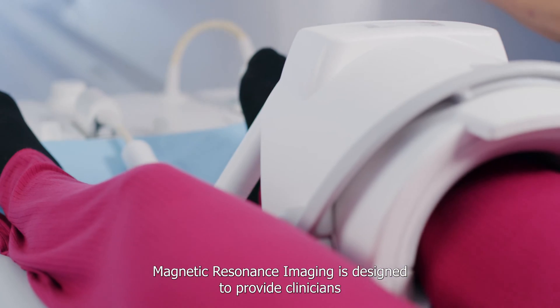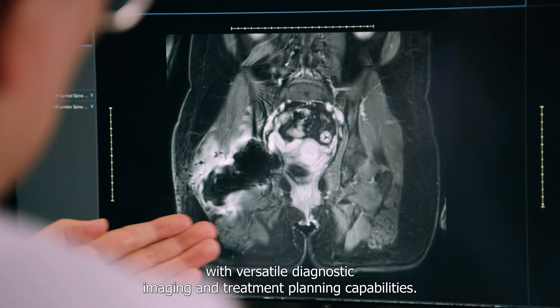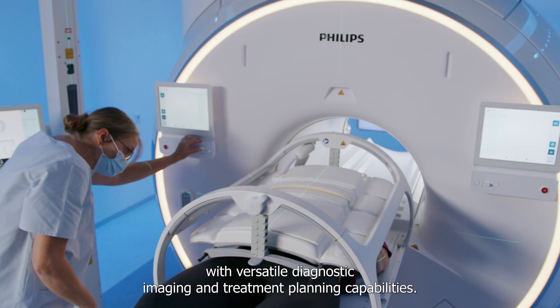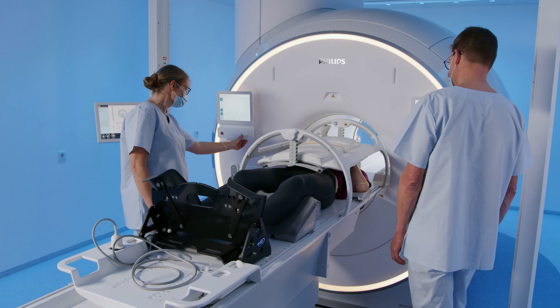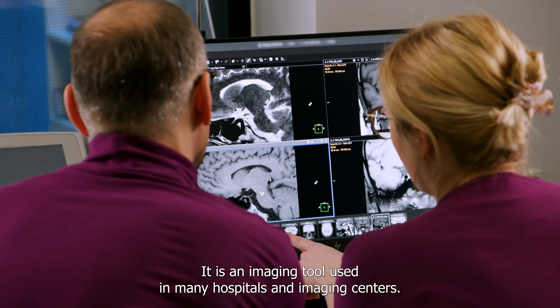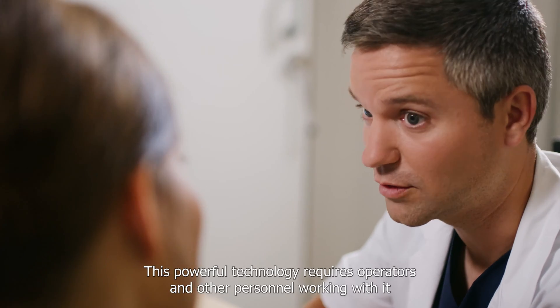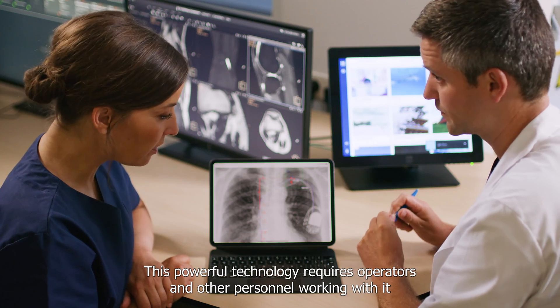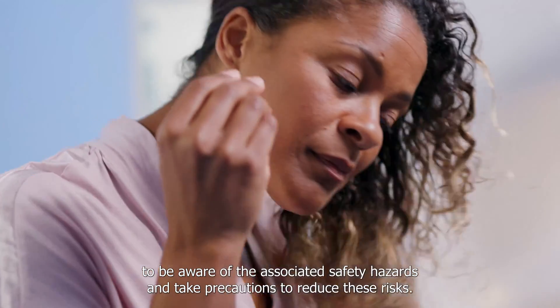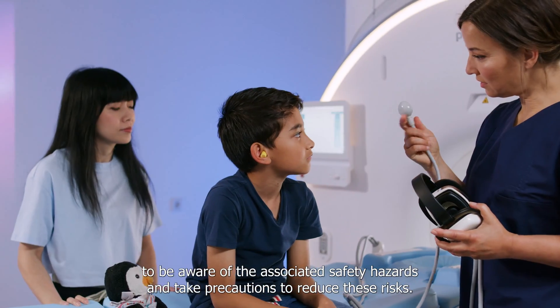Magnetic resonance imaging is designed to provide clinicians with versatile diagnostic imaging and treatment planning capabilities. It is an imaging tool used in many hospitals and imaging centers. This powerful technology requires operators and other personnel working with it to be aware of the associated safety hazards and take precautions to reduce these risks.